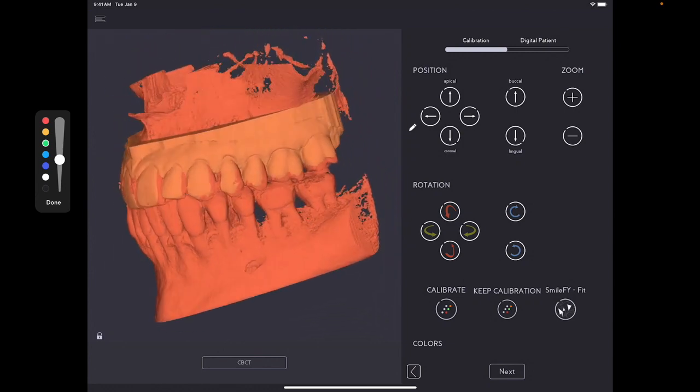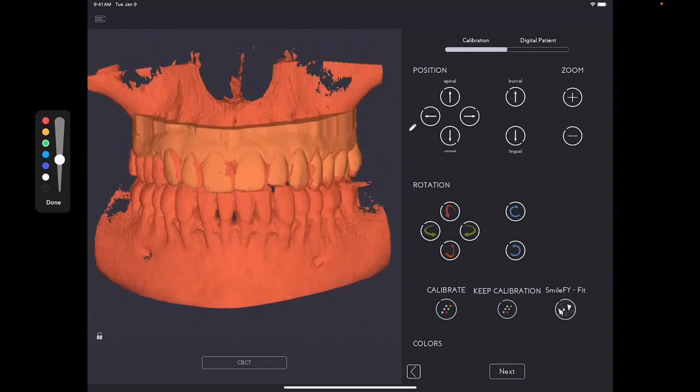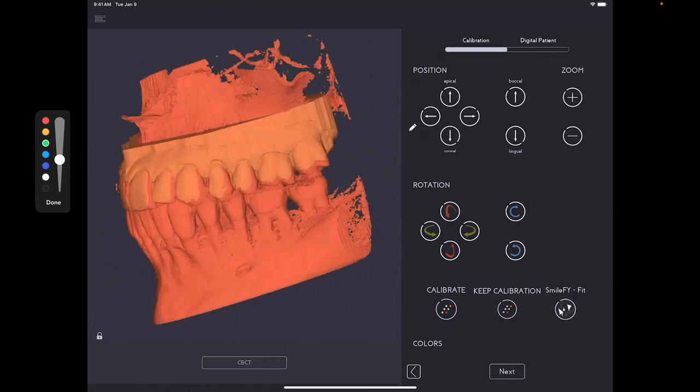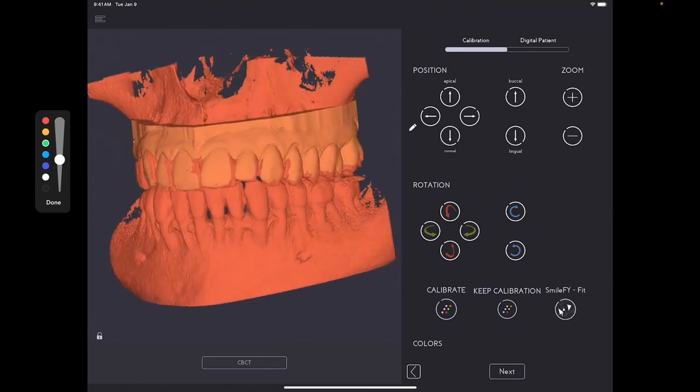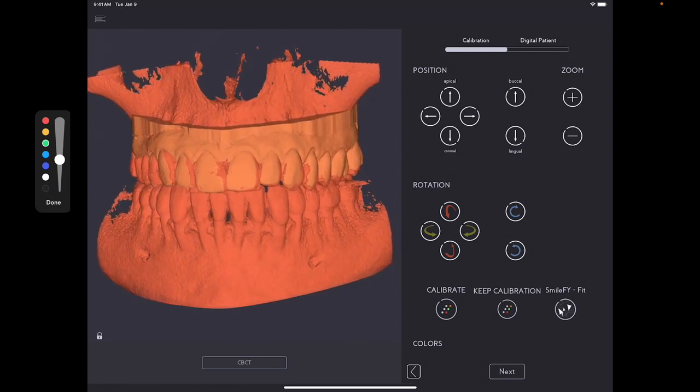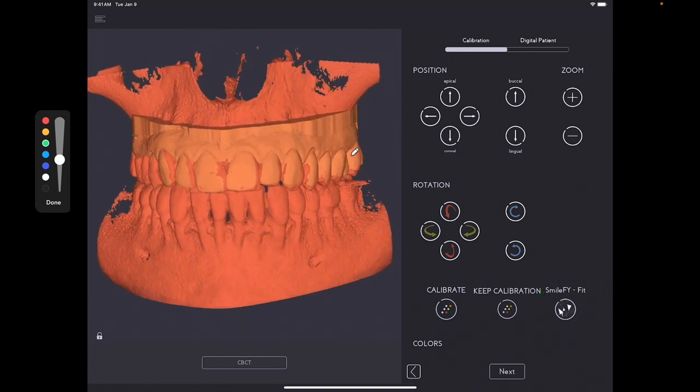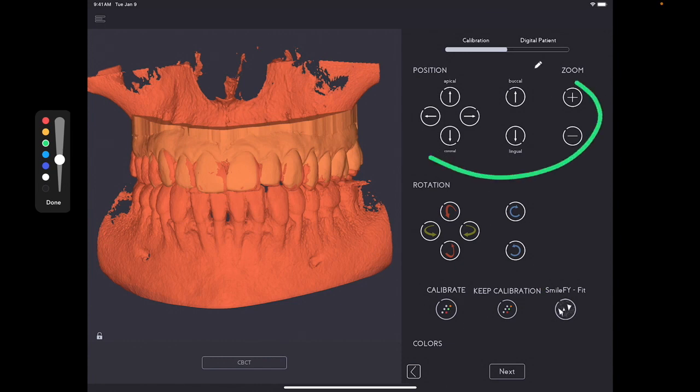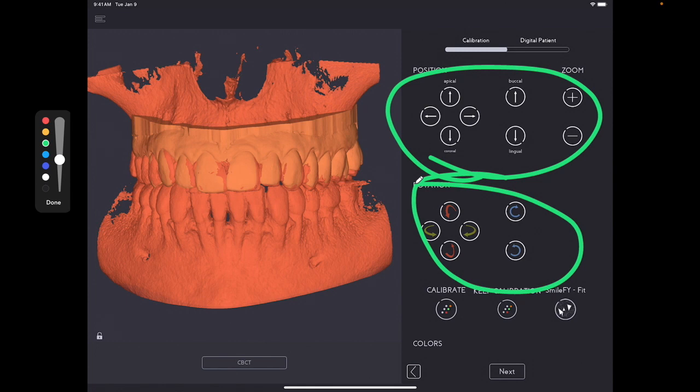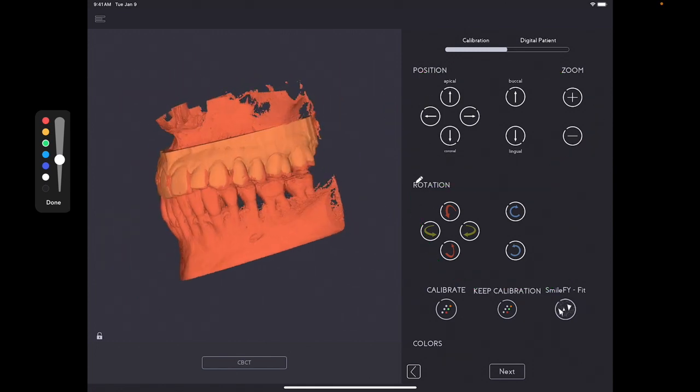So for the prep scan and the original STL, you can use this Smilefy Fit, which is this one. And then for the CT scan and the intraoral scan, you hit calibrate and use the commands over here to finalize your calibration.